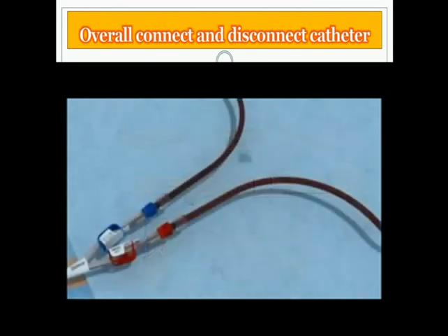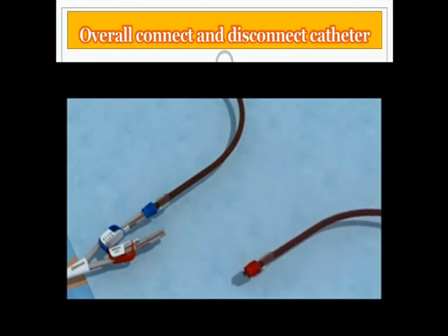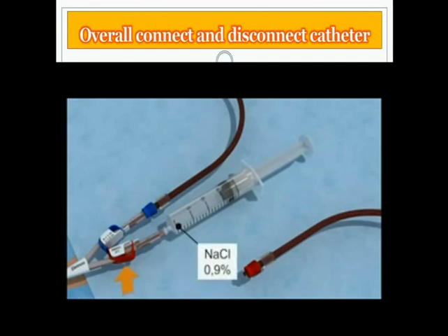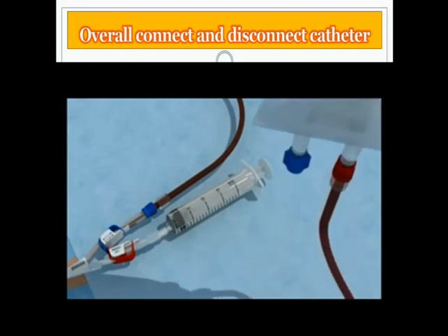Close the catheter clamps and disconnect the arterial bloodline. Connect the 20 milliliter syringes filled with sterile 0.9% saline solution and flush the arterial lumen. Close the arterial clamp. Connect the arterial line to the infusion bag with sterile 0.9% saline solution. Open the venous clamp and return the blood.